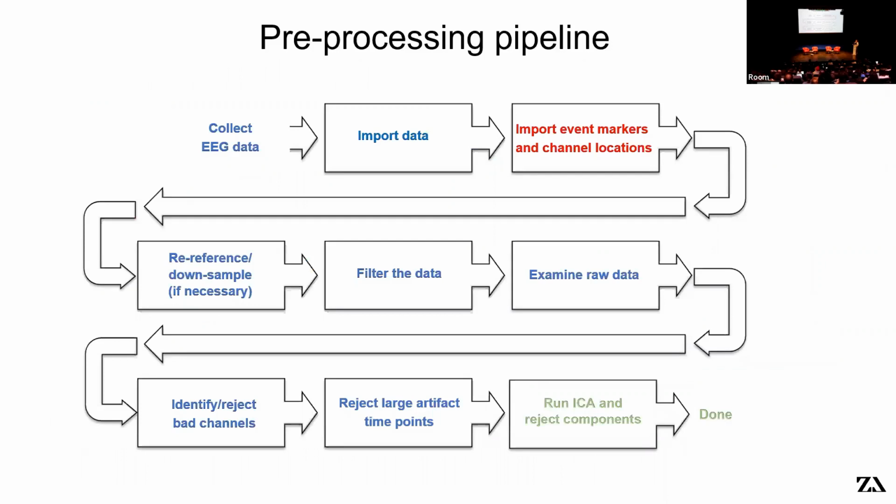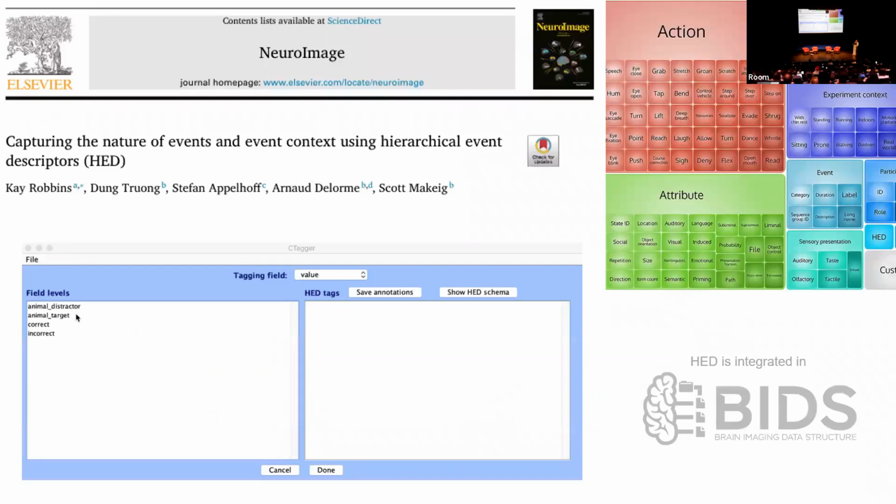Then the next step, once you have imported the data, is you need to import the event markers. And that's another problem because often event markers are not properly documented. Sometimes they're just even numbers, or maybe a one word label that you know means a button was pressed or something like that.